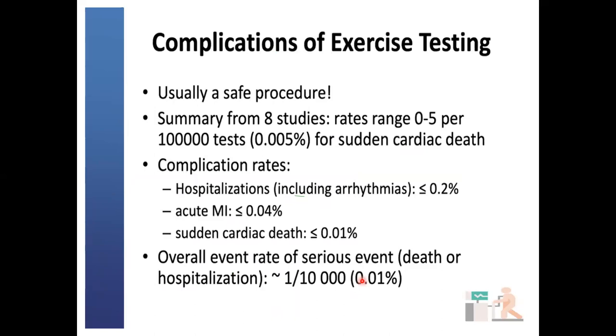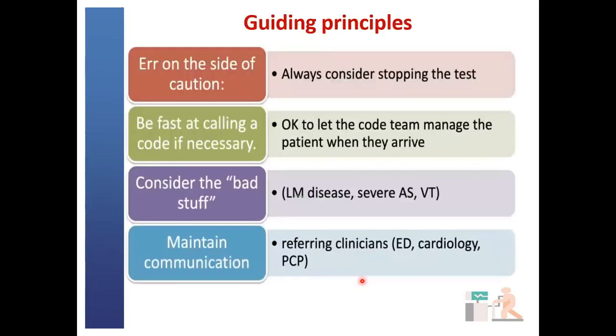Regarding complications of this test, it's generally described as a safe procedure. Complications tend to occur but are quite minimal, like I said, especially when the initial preparation and patient selection is optimal. In a study, sudden cardiac death was found in about 0 to 5 per 100,000 tests, which is just about 0.005%. Another complication rate, like hospitalizations, which include arrhythmias, was less than 0.2%. Acute MI was found in about 0.04%, and sudden cardiac death is 0.01%. So you can see that overall, complications in this test, particularly if it is done meticulously and appropriately, are very, very low and almost insignificant.